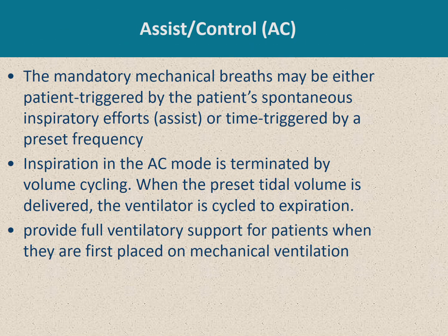The first mode of the volume control modes is the assist control mode, which will be displayed on the ventilator as ACV mode.